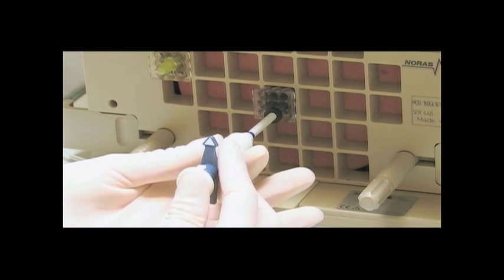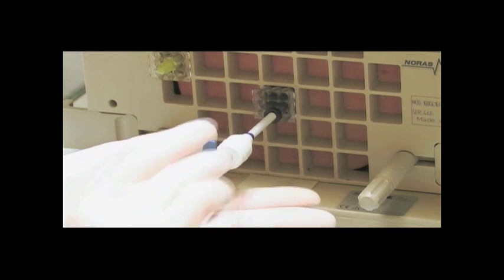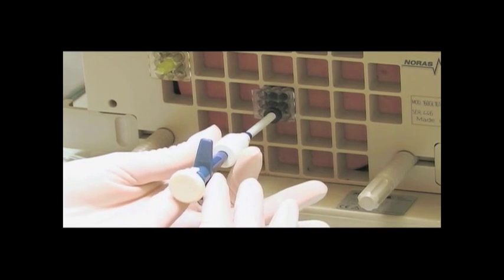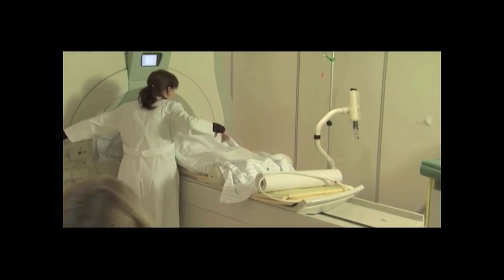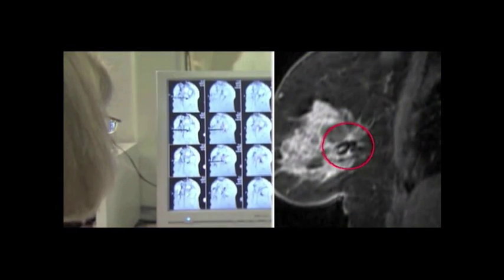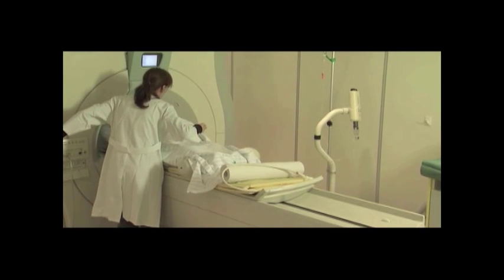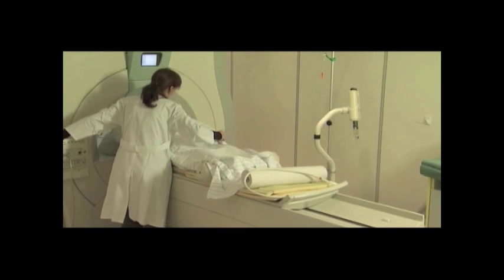Slowly remove the deployment device from the introducer sheath. Shuttle the patient into the magnet for verification of marker placement. Once the marker placement has been verified, shuttle the patient back out of the magnet.